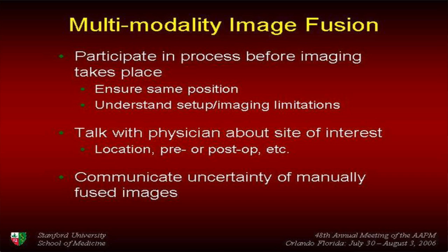So in terms of useful advice for imaging, if you can participate in the setup and imaging of the patient for the different modalities, this is often very difficult to do, but if you can, ensure that the patient is in the same position. And if you can't be there, at least understand what the restrictions on the imaging modality are. For example, if they're in an MR scanner, do they have a different head position and neck position than they had during setup because of an MR coil?